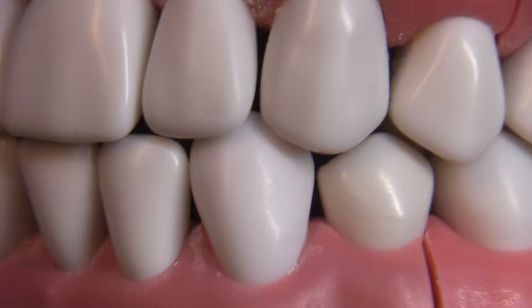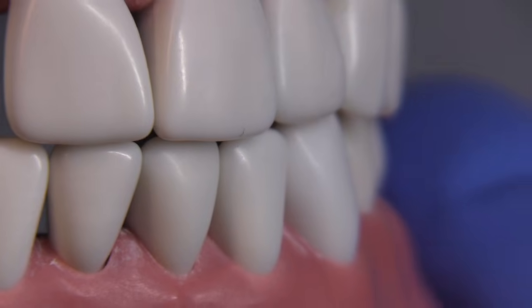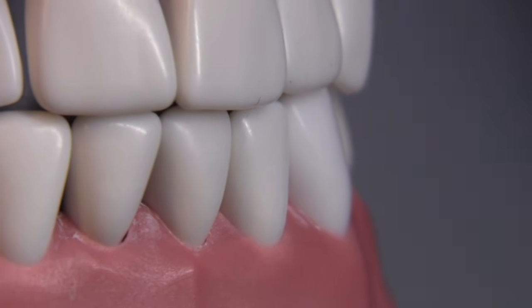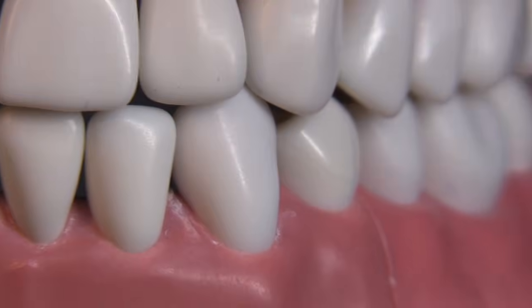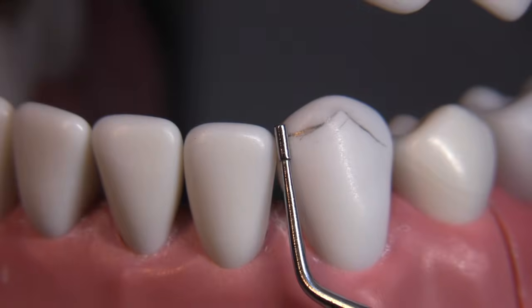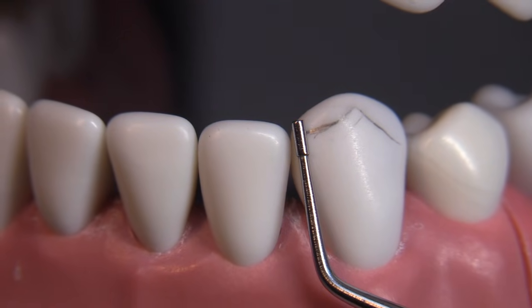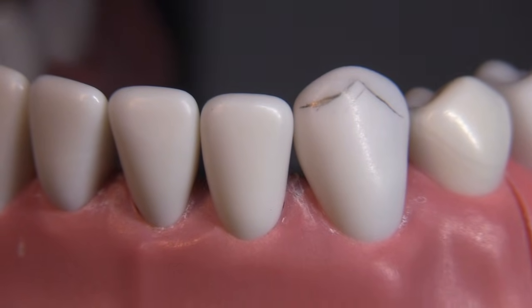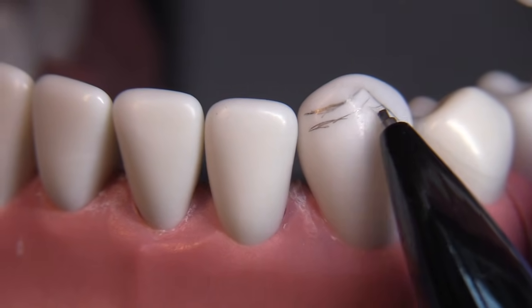One of the reasons why I think this prep is hard is because we really don't have adjacent teeth to mimic. The tooth has contours that are quite unique — notice on the facial how it has this very long contour on the occlusal two-thirds and a more upright contour on the gingival third. It's not shaped like any other tooth, so we have to use the tooth itself as a guide.